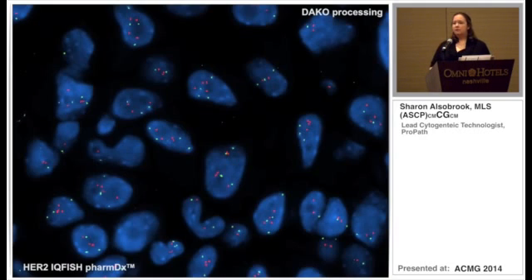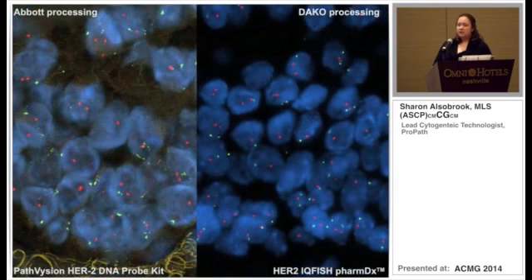All these images are taken full gated. There's no gating on any of the filters. Full exposure with no cleaning, nothing. This is a full image. This is what we saw through the scope. Here's a side-by-side comparison. These are all the same samples. These were done side-by-side.